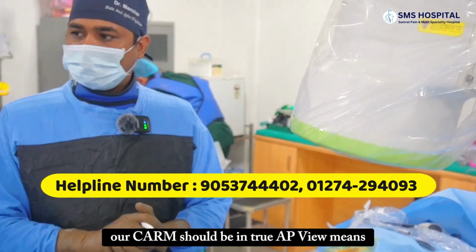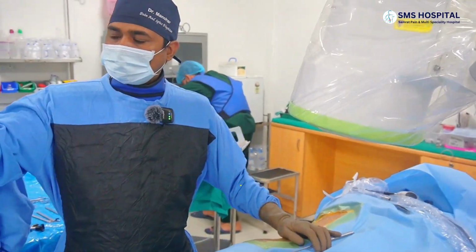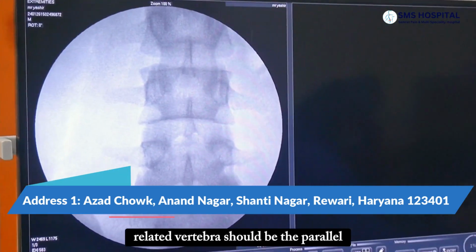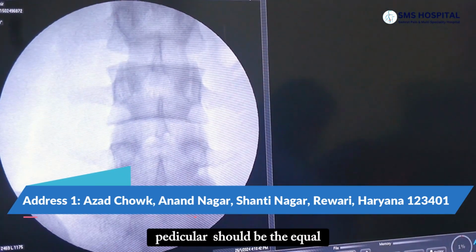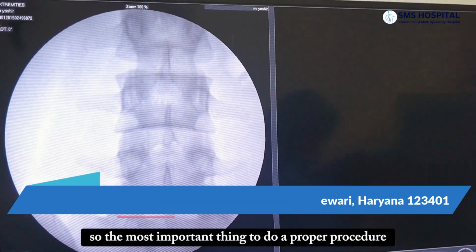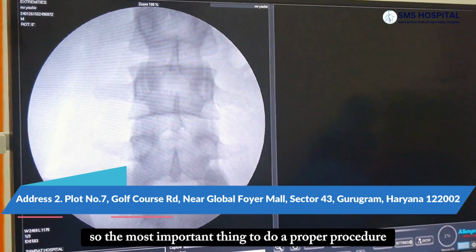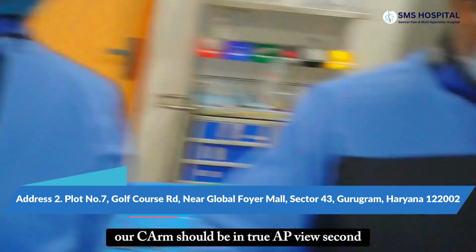Our C-arm should be in a true AP view. True AP view means the end plates of the related vertebra should be parallel, and the distance between the spinous process and the pedicle should be equal. So the most important thing to do a proper procedure is that our C-arm should be in true AP view.